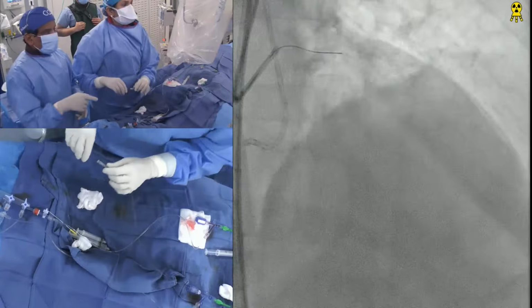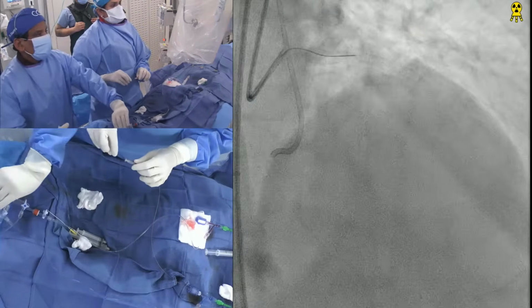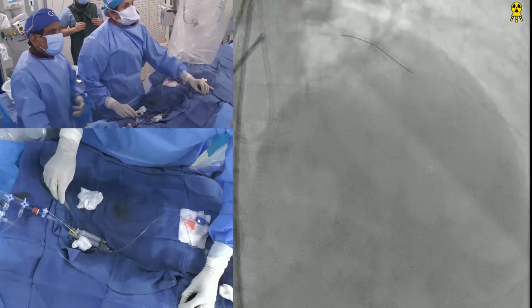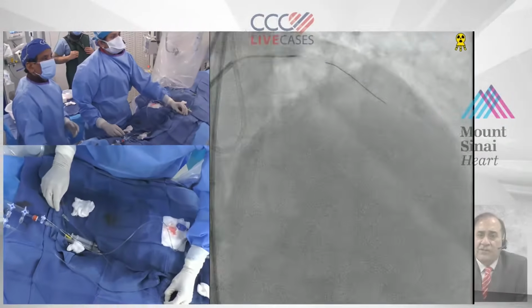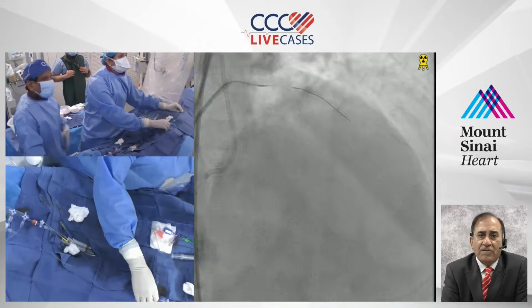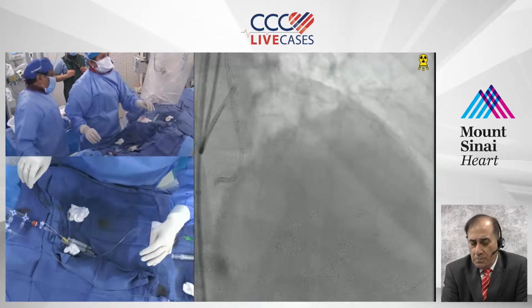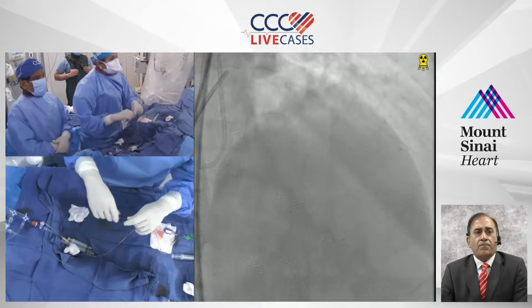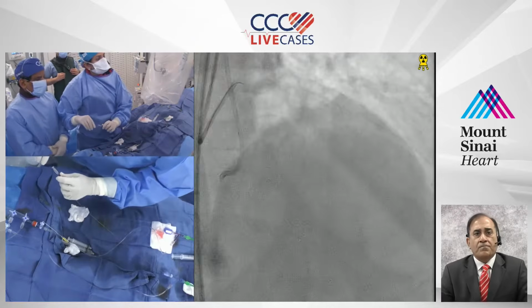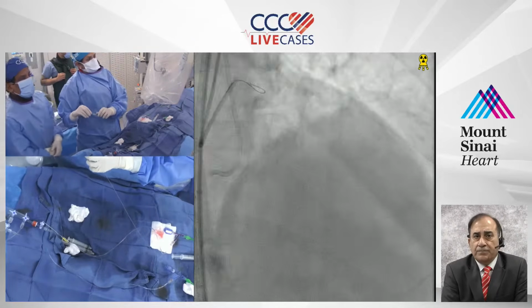So you have to make a new curve now. Not only in this particular case, maybe also with bifurcations when you're doing all sorts of strategies. Is there a particular wire you've seen which is more beneficial in getting you through the struts of a previously placed stent? Oh yeah, definitely. I would say the Fielder or the Whisper. I found the Whisper even much better than Fielder going through the struts. Definitely, Runthrough is not your wire for that purpose. Runthrough and BMW are not the wires.